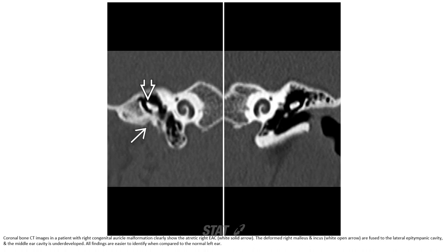Coronal bone CT in a patient with right-sided auricular malformation clearly shows the atretic bony ear canal. The malleus and incus are fused to the lateral wall, and the middle ear cavity is underdeveloped. These findings are easy to identify when compared to the normal side.